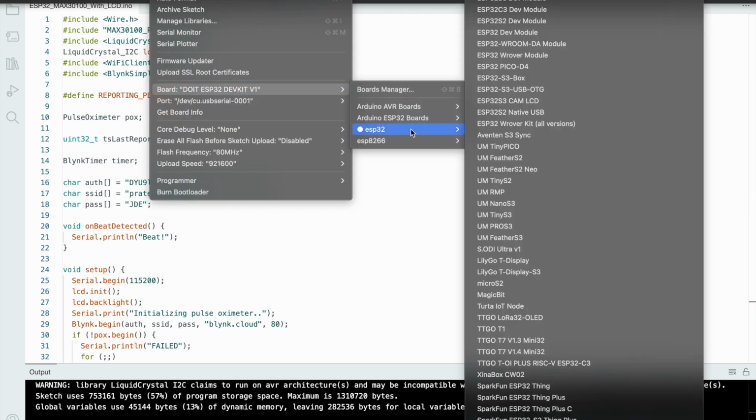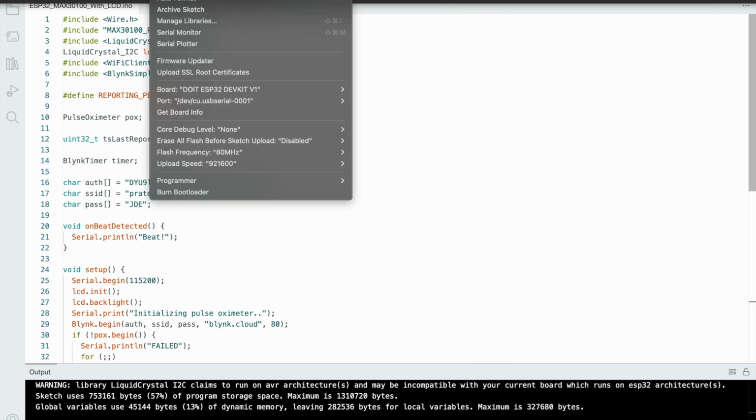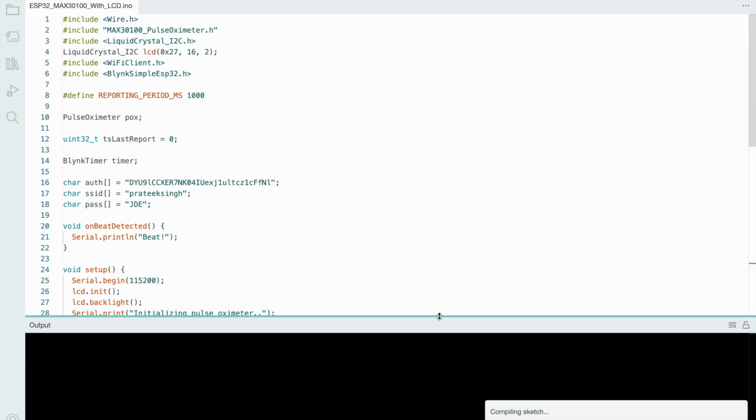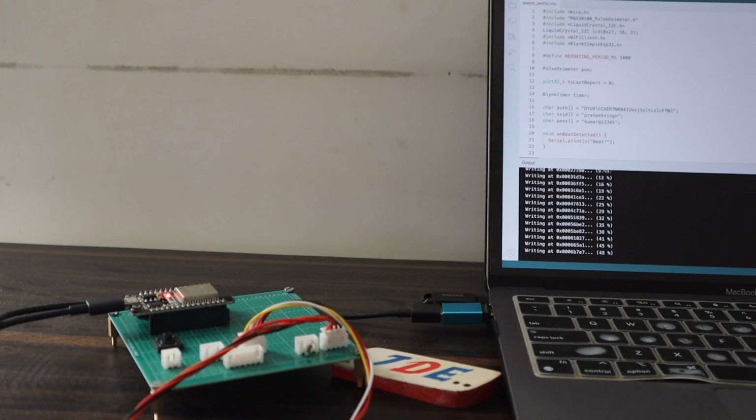Okay, now go to tools, select the proper board, go to tools again, select the proper port and hit the upload button. Now after a few seconds the code will be processed and uploaded. See, the process will start and the code will be uploaded to this ESP32 microcontroller board.